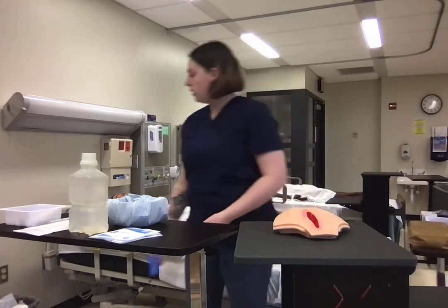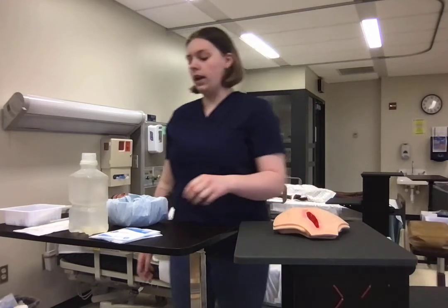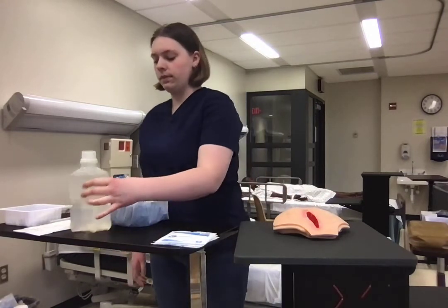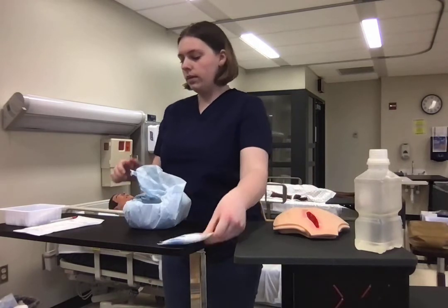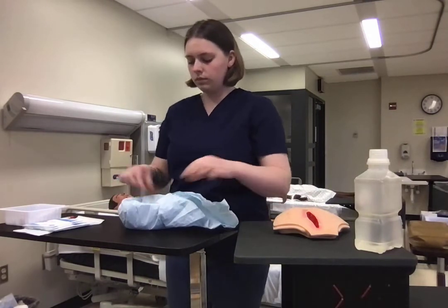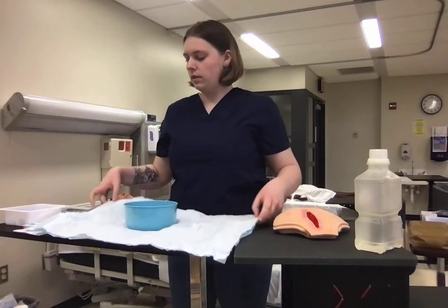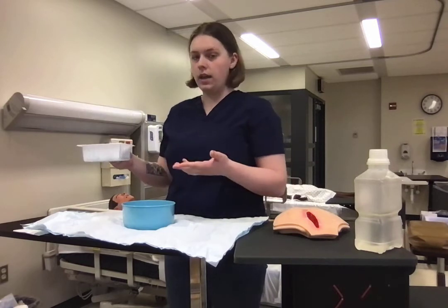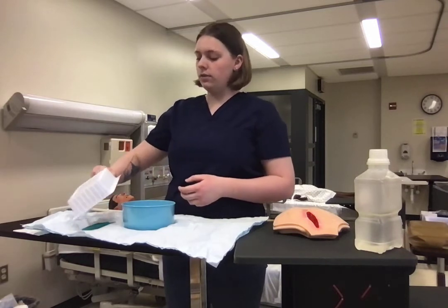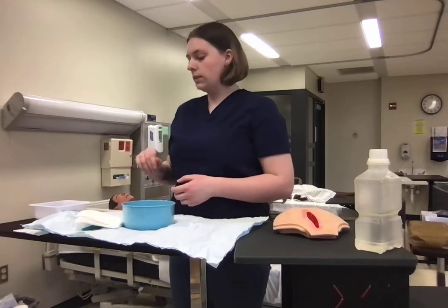And at this point, I will begin to set up my sterile field for my complex sterile dressing change. All right, I'm gonna go ahead and open up my bowl and establish my sterile field. Okay. And I will take my complex sterile dressing tray and dump that onto my sterile field. And I'll leave that for a gauze boat.